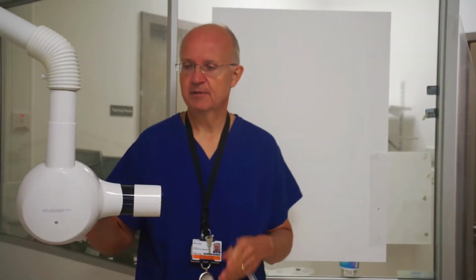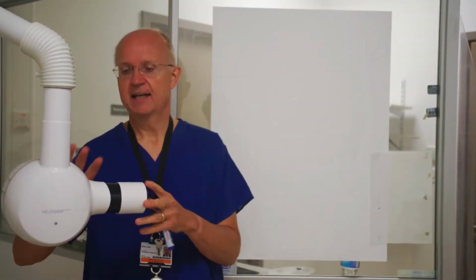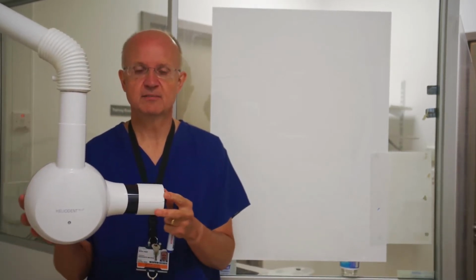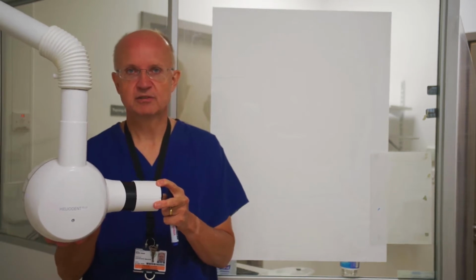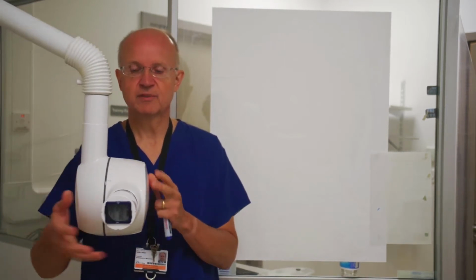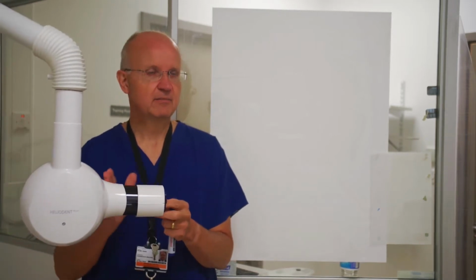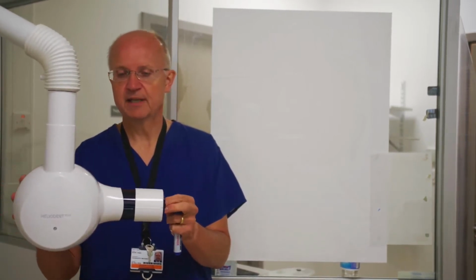Okay, so we talked a little bit about the X-ray tube and the various parts of the design of the tube that help protect the patient. So we have some shielding around the back, and as Sarah mentioned, we have the collimator on the front. And inside, you may remember there's the aluminium window. We'll talk about that in a minute.